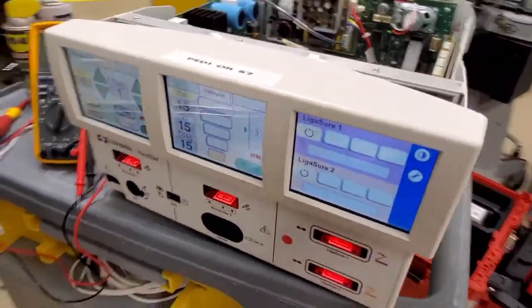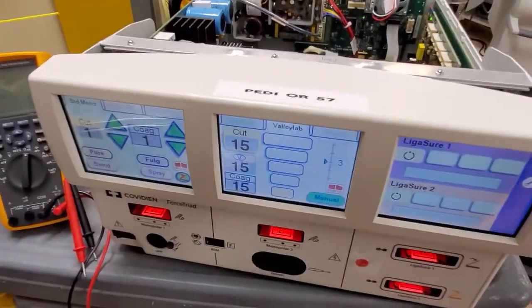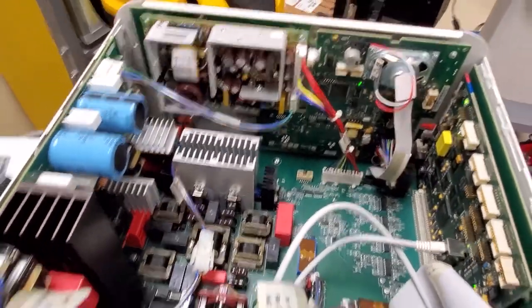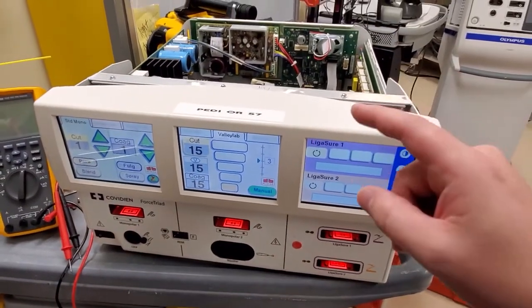Hey guys, welcome back. This is a forced triad and you can see that I've got it open because moments ago this guy would not turn on. On the inside you can see I actually have this guy running perfectly fine. Why? Because it's actually a simple failure — it's something that's been going on for years.